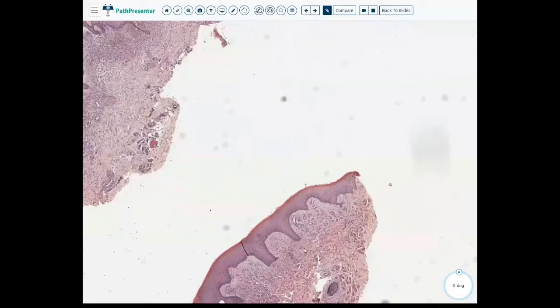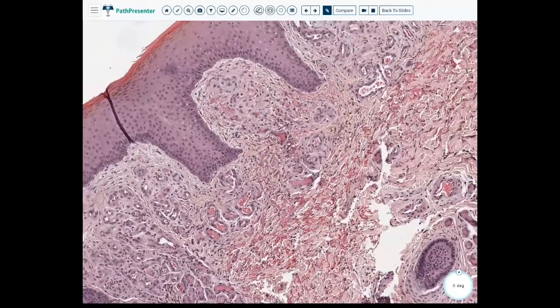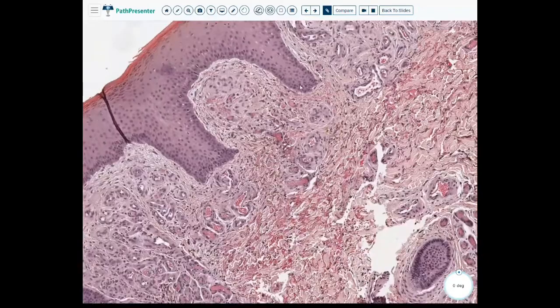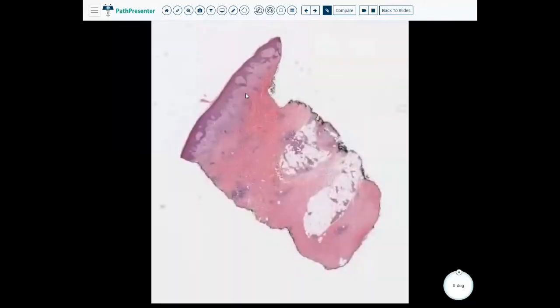And if we go to the smaller piece, which in all these cases I won't necessarily go to all pieces because we're just, again, trying to hit the major points, we again see this big lobular formation, maybe a little bit of increased fibrosis. But these aren't really truly inflammatory. They're very, very vascular lesions. So this is, again, stasis dermatitis.